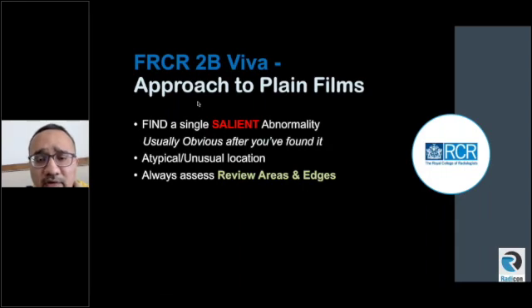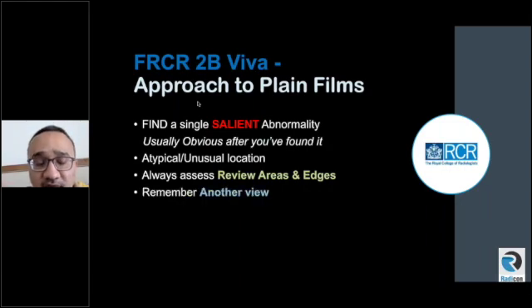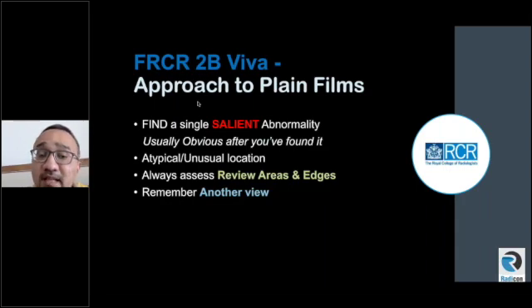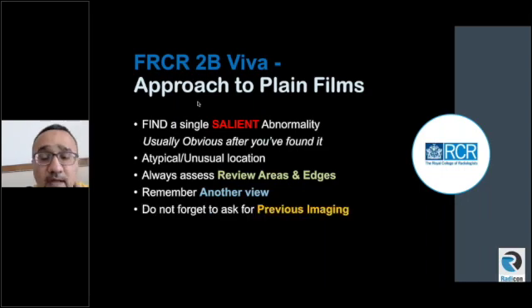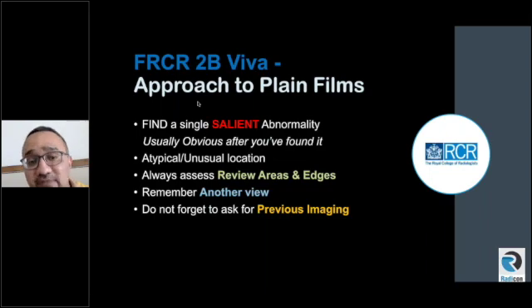Another important point is don't forget the margins or edges of the film. When we are looking at a film we focus on the center of the image and forget the edges, yet pathologies or important information is often hidden at the edges. Once you have found an abnormality, in normal practice you always ask for another view. The exam is about replicating normal day-to-day safe radiological practice, so remember to ask for another view, and once you have exhausted the information on the film, don't forget to ask for any previous imaging.